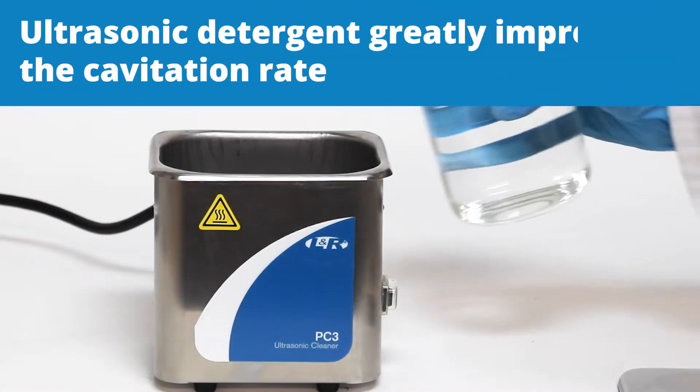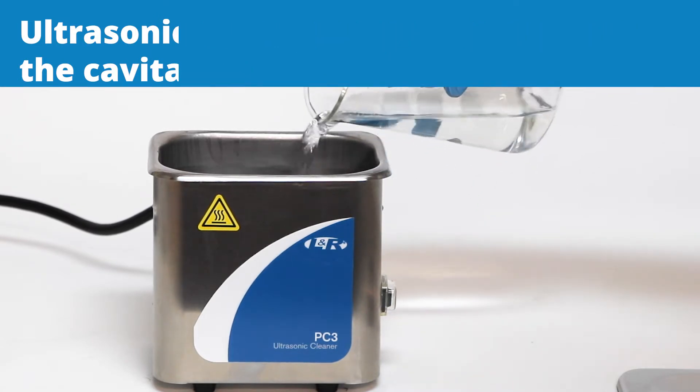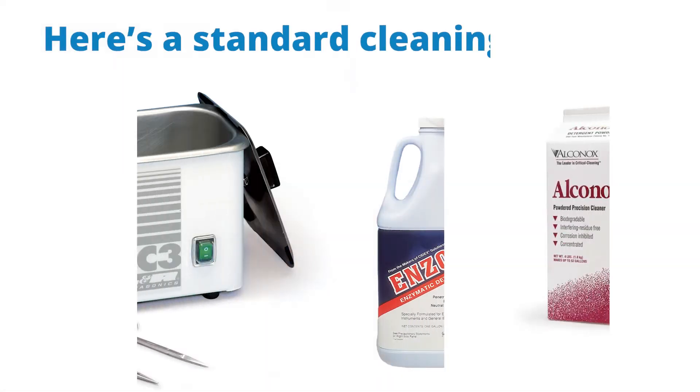Use of ultrasonic detergent greatly improves the cavitation rate as opposed to plain water. Here's a standard cleaning protocol.